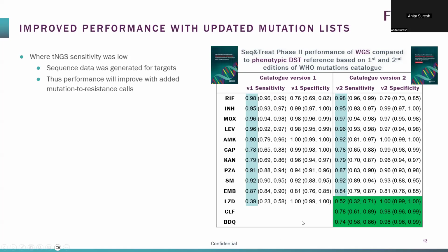Based on that, we actually increased. There was a lot more data that was added. I showed you it was another 15,000 samples overall. You could see suddenly you're seeing 78%, 74% sensitivity for these two drugs.